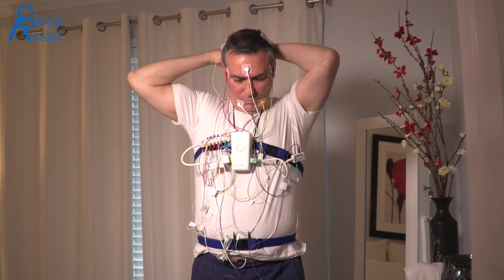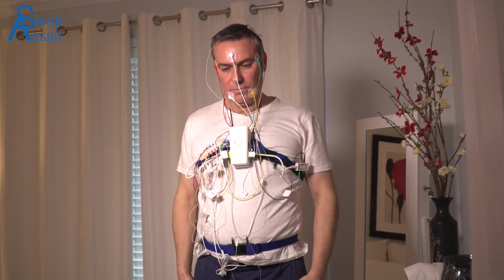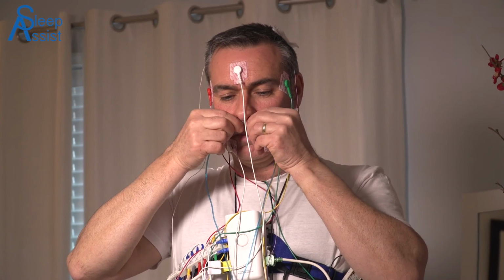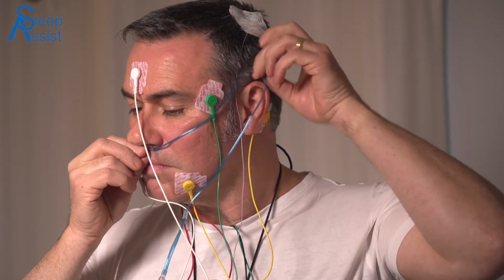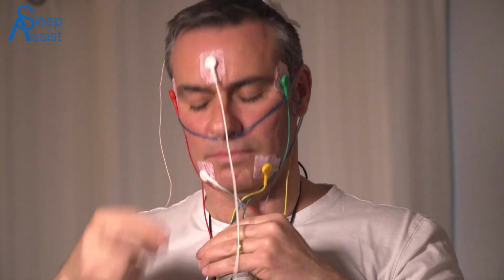You do not have to be in bed asleep by 10 p.m. The recording will show when you are attempting to sleep. Step 17. Before going to bed. With the cannula bending in towards your nose, run the tube up and over your ears and then under your chin like the drawstring of a hat. Tighten by sliding like a tie.